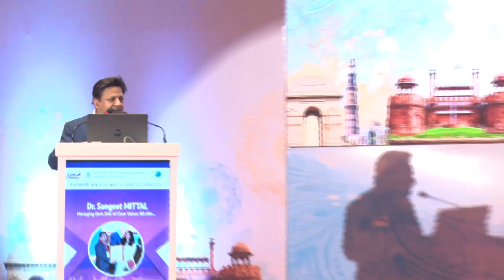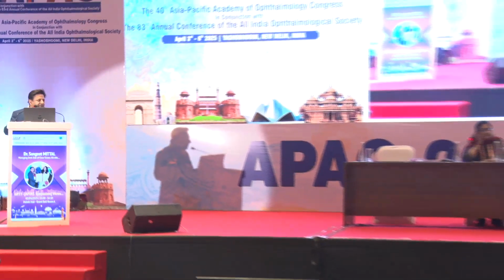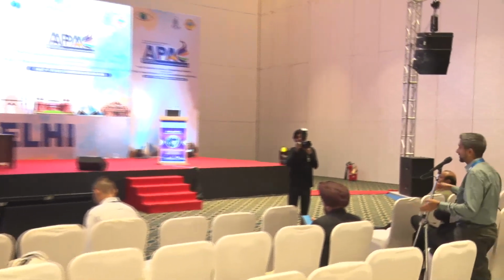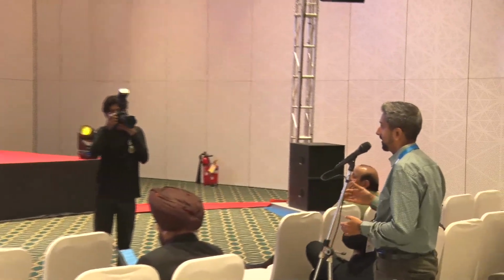Any questions from the audience? Sir, I have one query. Most of the time in these referred cases, the tunnel is pretty bad. They have already put some 3-4 sutures. So the minute you put it, your infusion becomes a washing machine, and the IOL starts floating around and hitting everything. So do you like to make a separate tunnel superiorly, close this properly, or do you just proceed with the same thing, or how do you do that?